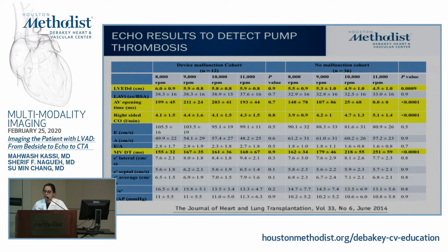In that situation, ordering this ramp study is probably relevant, because the most important discriminator is the LDH. If that is not helping me make that determination, then the echocardiogram would help me see if truly the pump is unloading or not. And then documenting all these parameters is important.